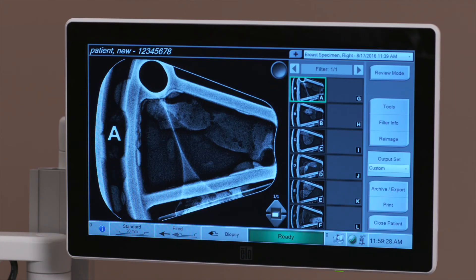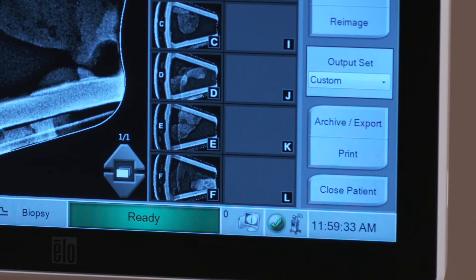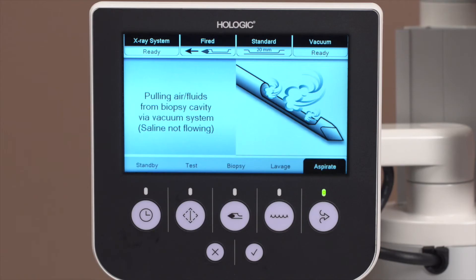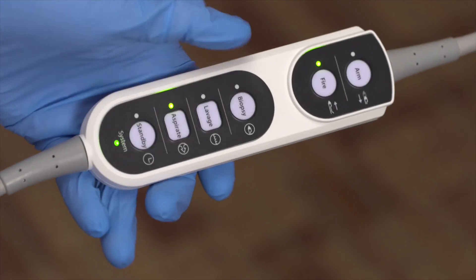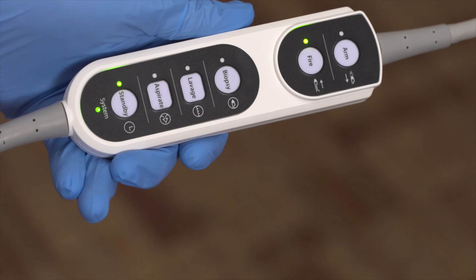You also have the option to send the images to your designated printer using the print button. When the physician is ready to complete the procedure and remove the needle, the technologist, from the technologist display, or physician, from the remote control, will place the system into standby mode to close the aperture.